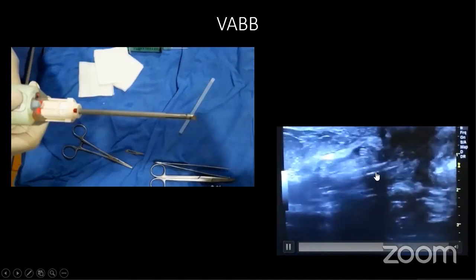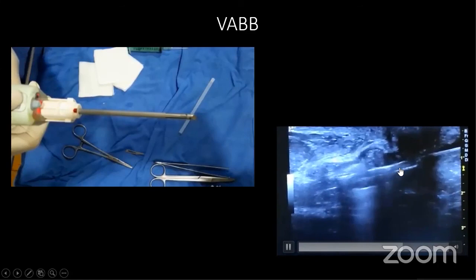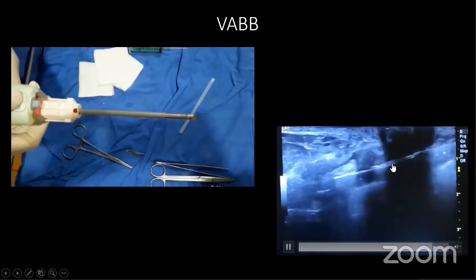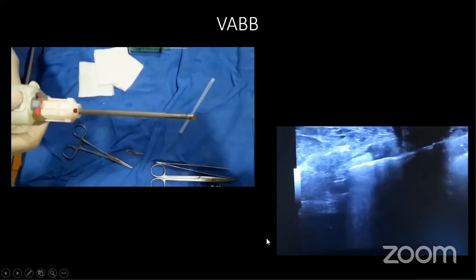So see that we have advanced this vacuum assisted probe here, and see the lesion is pulled in the trough, and then the needle will advance here to cut it. So we obtain a large chunk of tissue, and luckily this patient had only some evidence of granulomatous mastitis, which was causing her nipple retraction, no malignancy.